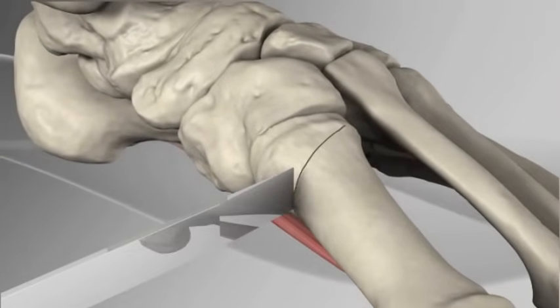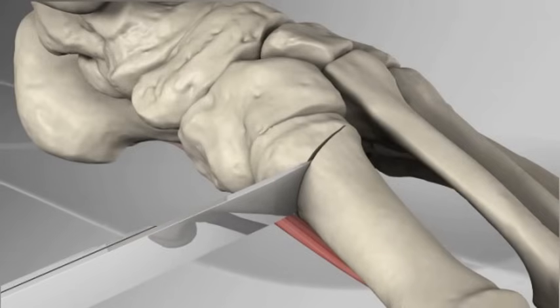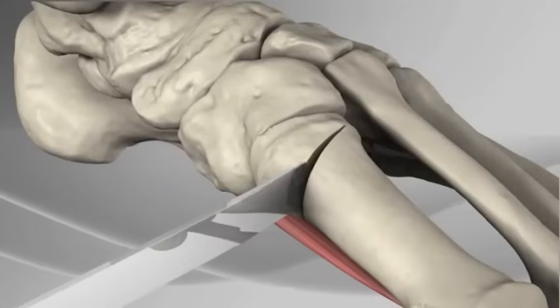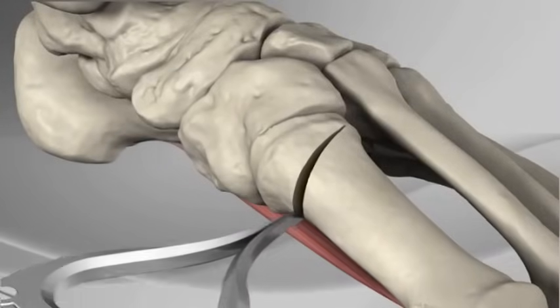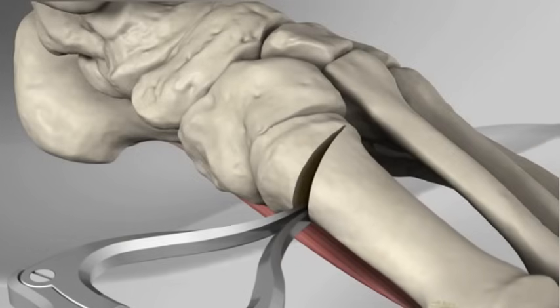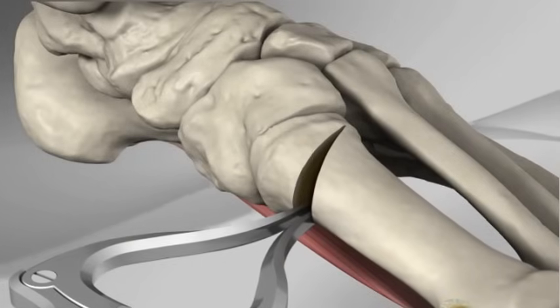An osteotome or orthopedic chisel is used to enlarge the cut. A jack is then inserted and the saw cut is further widened until the bunion deformity is corrected.